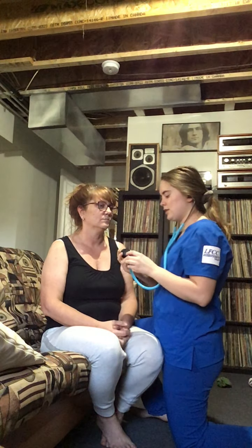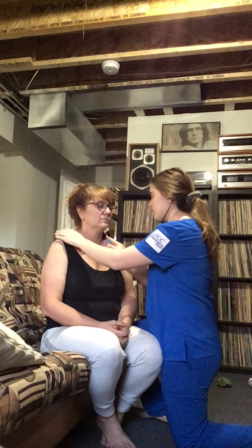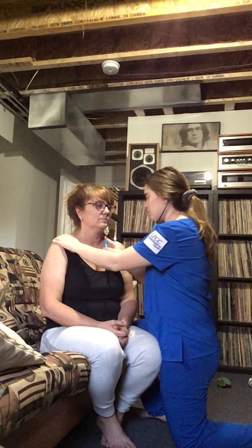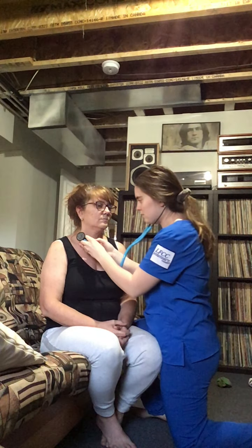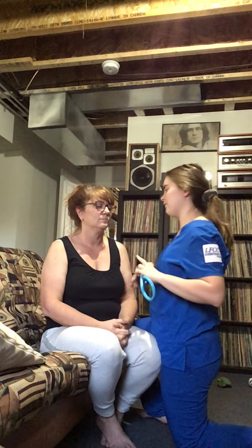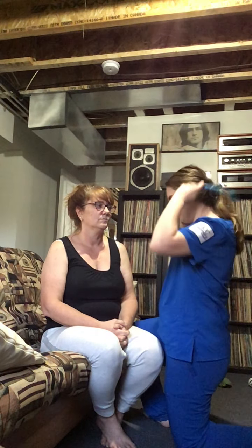Again, I hear air moving in and out of the trachea, which is a normal finding, and I hear a normal pulse rate. No bruit and no turbulent blood sounds. I'm going to listen with the other side of my stethoscope. Again, I hear the same findings as I heard with the diaphragm of my stethoscope. Everything is normal. Next, I'm going to move on to inspection of my patient's chest.